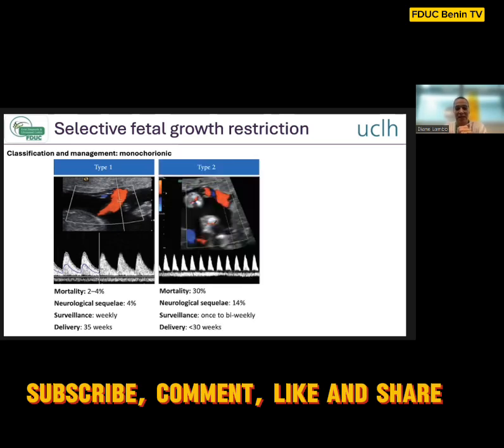Type 2 is a slightly different picture. Now, in type 2, you have absent or reversed end diastolic flow. You can see the difference between type 1 and type 2. What they've done here in type 2 is that they've reduced down the speed at which they're measuring the umbilical waveform. So you can see that within that excerpt, you've got many more waves compared to type 1. And the reason they do that is because what they're trying to exclude is type 3, which I'll show you on the next slide.